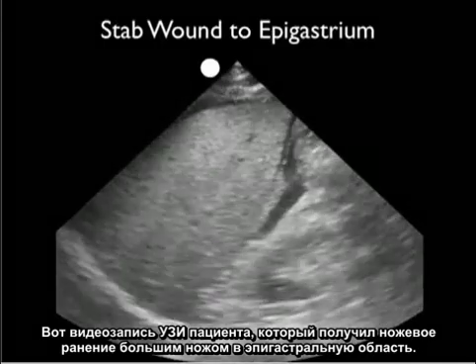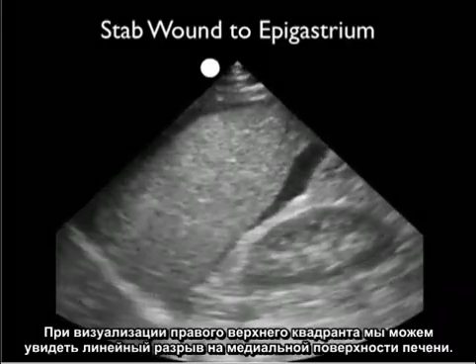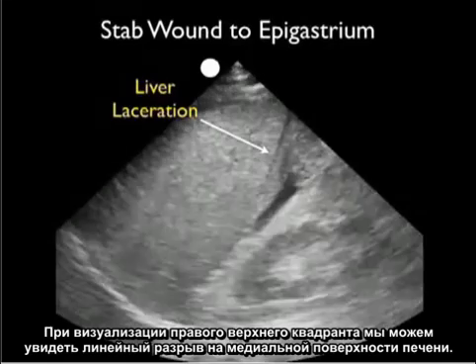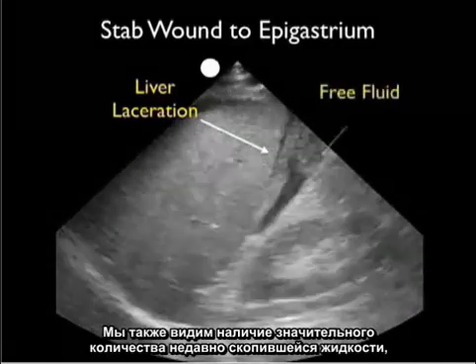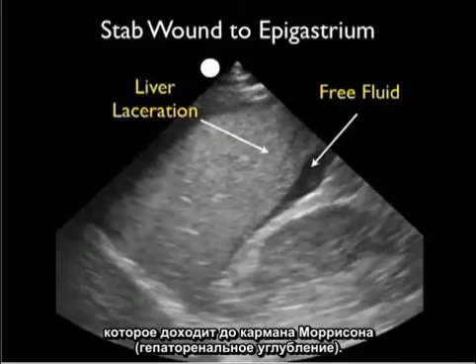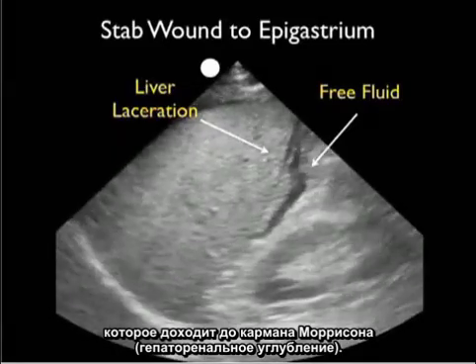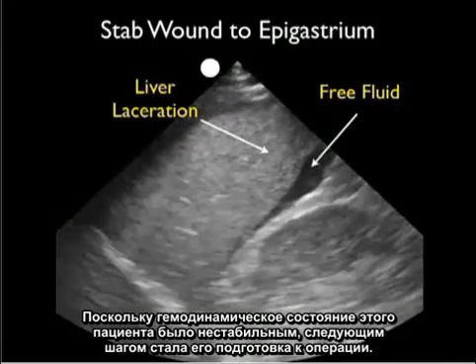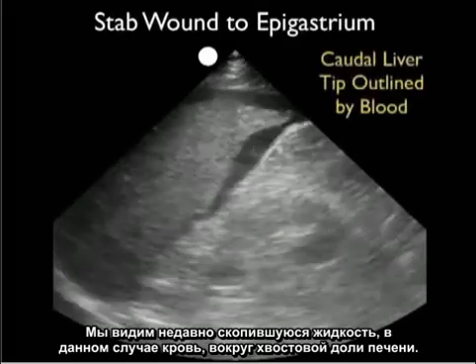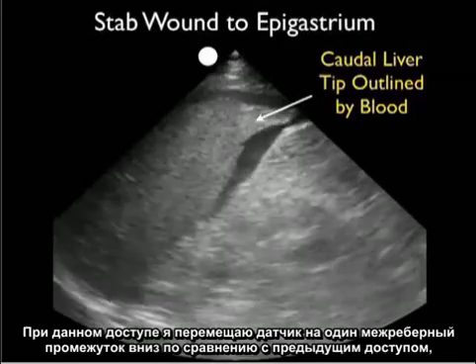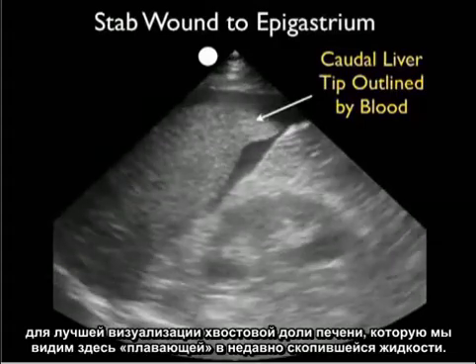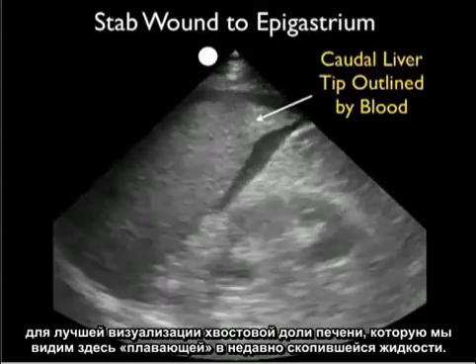Here's a video clip from a patient who was stabbed with a large knife to the epigastric region. As we look at the right upper quadrant, we can see a linear liver laceration extending through the medial aspect of the liver. We also appreciate a large amount of fresh fluid — that dark or anechoic fluid collection layering out posteriorly to the liver and extending into Morrison's pouch, the hepatorenal interface. As this patient had unstable hemodynamics, the next move was to prepare for the operating room. We can see the caudal tip of the liver waving around in all the fresh blood, a view obtained by moving the probe one intercostal space inferior.